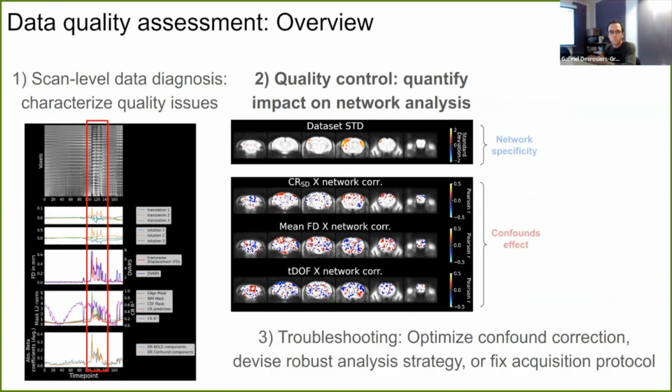I guess more of a question for discussion. When you're approaching a data set, do you usually see the same kinds of problems or indications that you need a certain kind of pre-processing occur throughout scans, or are there some data sets where they're just extremely variable? Like one might have more motion, one might need low pass filtering.